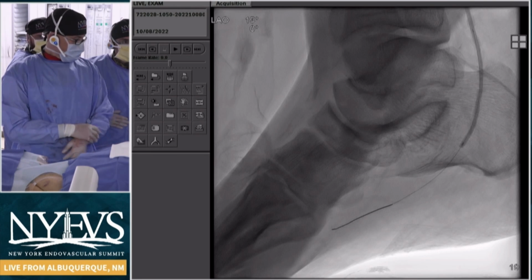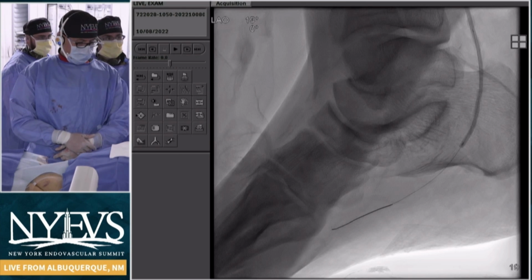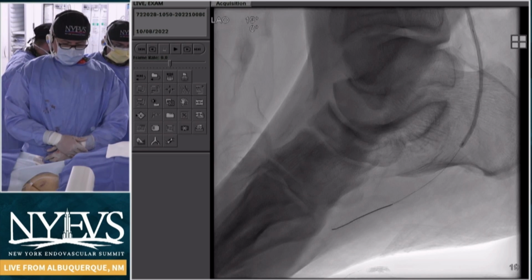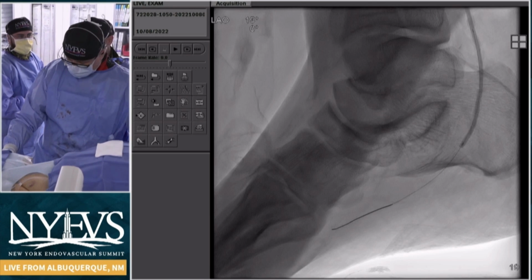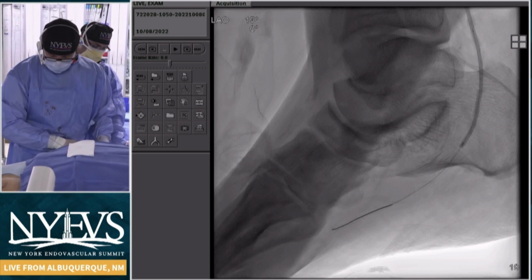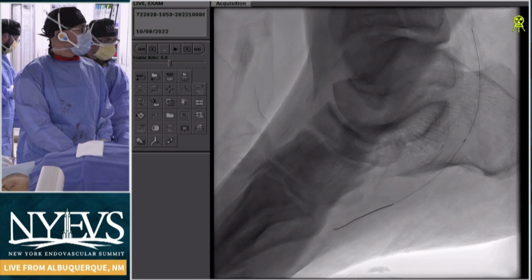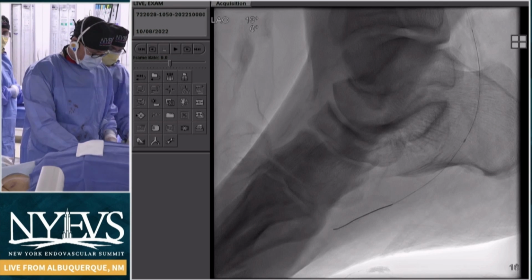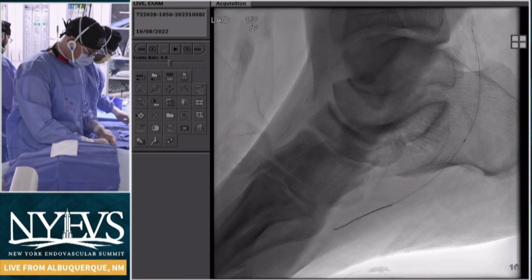George? Yeah, and I think the other thing is the emergence of some of these newer devices and technologies that might help us know when we've achieved our goal. Because I don't think there's any harm in waiting and staging. But also, if you reconstruct tibials and you've got a device that tells you your tissue oxygen content is good, you've got favorable conditions for wound healing, then you can stop and not put yourself in a position to make things worse. We've all hit on it, but I can't stress enough how easy it is to mess this up. Yep. Very easy to mess this up, and you have no bailout at that point.